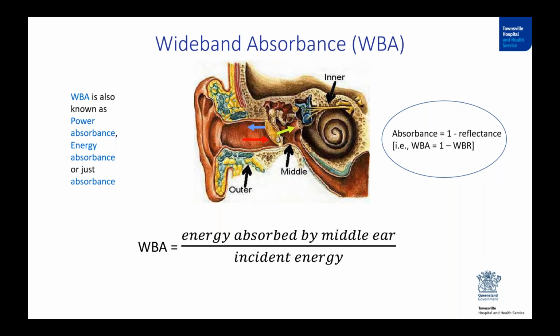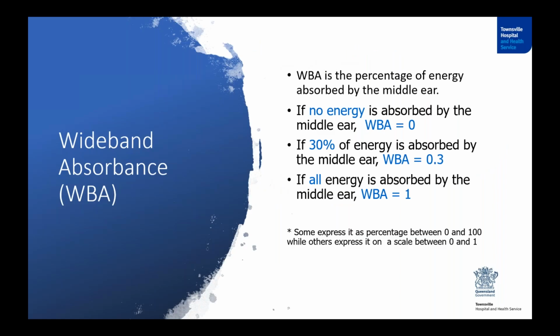So if you look at wideband absorbance, we can present it either in terms of percentage or a decimal. So if no energy is absorbed at all, if all the energy is being reflected and no energy is being absorbed, then absorbance is 0.